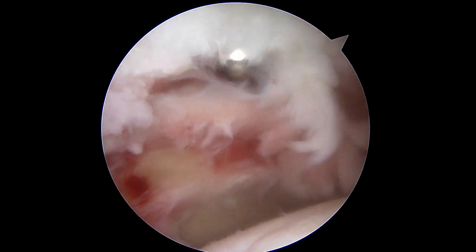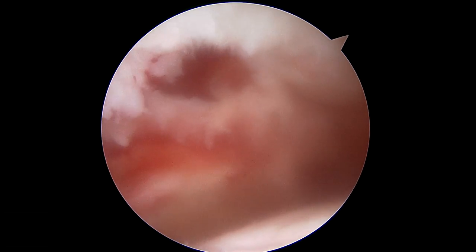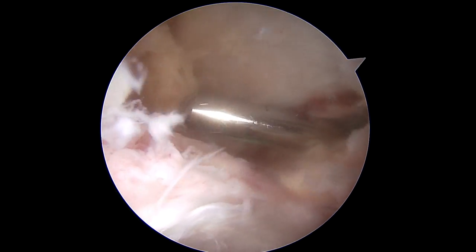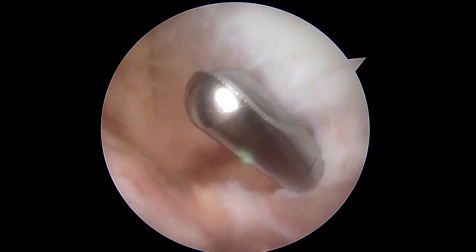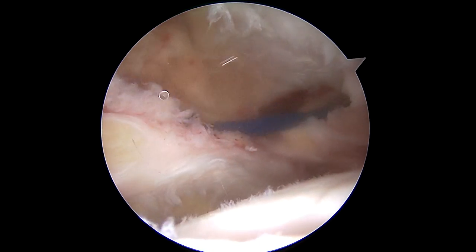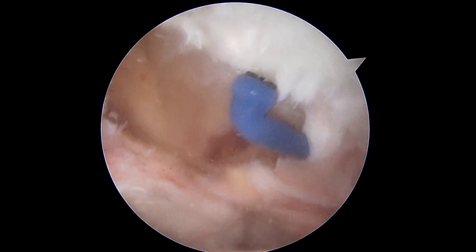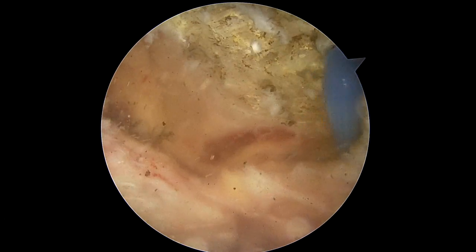There's not going to be much cuff there — I can guarantee you that. Once we have that little hole where we can see up in that space, we can use our cautery and switch back between cautery and shaver as needed. There's a good view of the scapular spine, but you've got to be able to see that to know which part of the cuff you're dealing with. Basically there's no supraspinatus. Here's the biceps root, here's the labrum. This little layer of trash tissue is kind of what would have been supraspinatus — there's really nothing there to speak of.